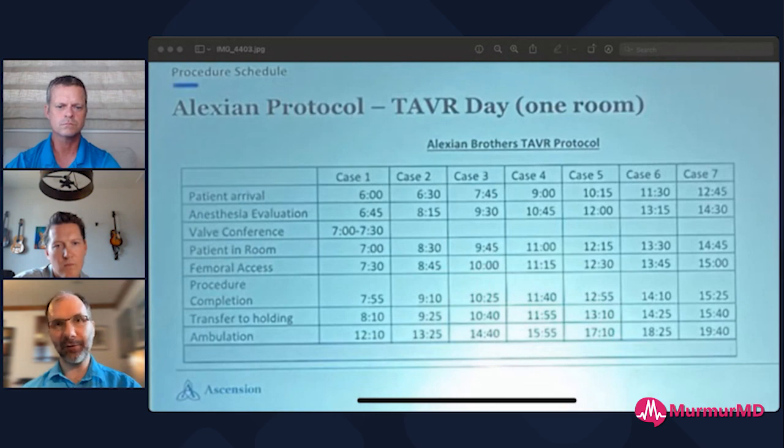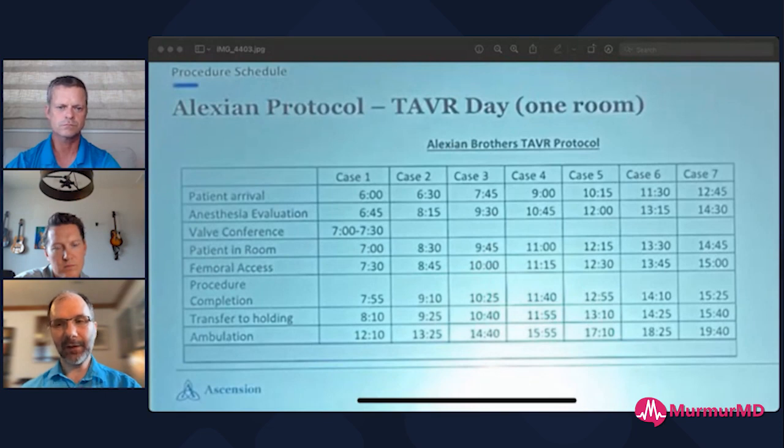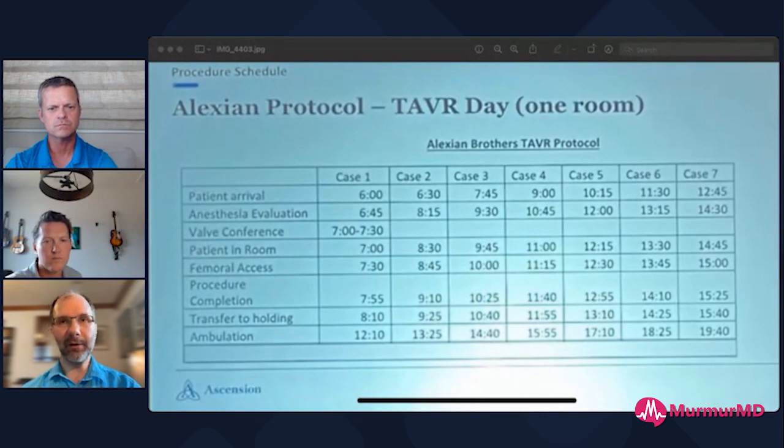And in this 15 minutes, the rest of the team basically takes the room apart. They take all the equipment, they throw it away, they assemble the trash bags. And then by the time the patient is ready to roll off the table after they had a full neurologic exam, well, a limited neurologic exam done by the team, the anesthesiologist has already left and has gone to see the next patient. And as the patient rolls out of the room, the housekeeping person comes in and starts cleaning the room. And housekeeping doesn't do any of the heavy lifting of cleaning the tables because that's not really their expertise. They come and wipe everything, but they don't deal with any of our equipment. That's all done by the staff that has been in the room in the 15 minutes that the groin is being held.